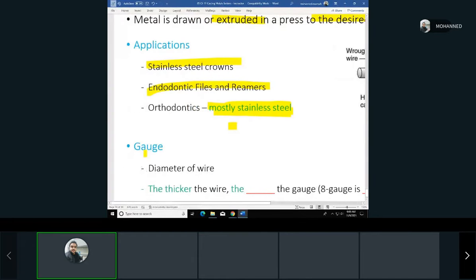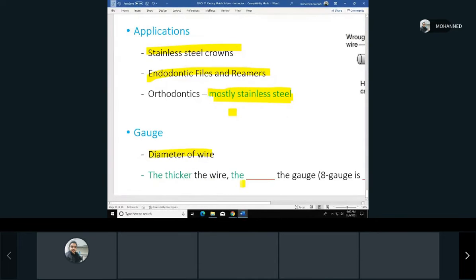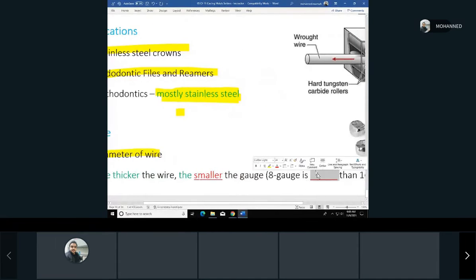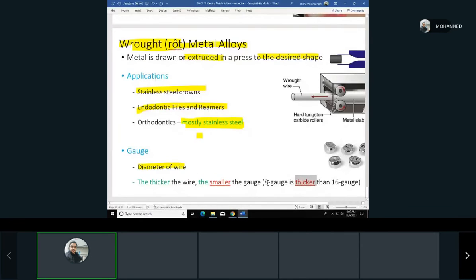When we talk about wrought metals, because they're extruded or pulled, we talk about the gauge, which is the diameter of the wire. The thicker the wire, yes, the gauge is, which means an 8 gauge is thicker than a 16. And you know why? The more the number, the thinner the wire, because technically the number is how many times they pull it through. So the more you pull it through the machine, the smaller it gets. You're pulling and pulling and pulling, and it gets smaller and smaller. The less that you pull through the machine, it means it's still thicker. That's why the number is that way.